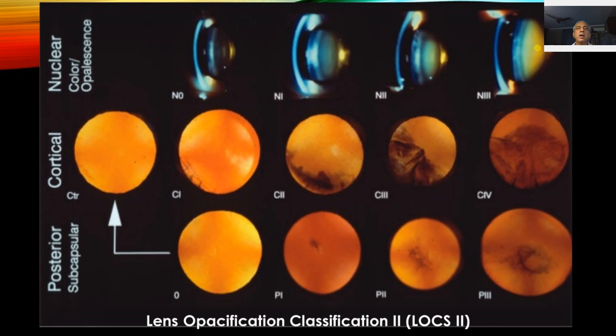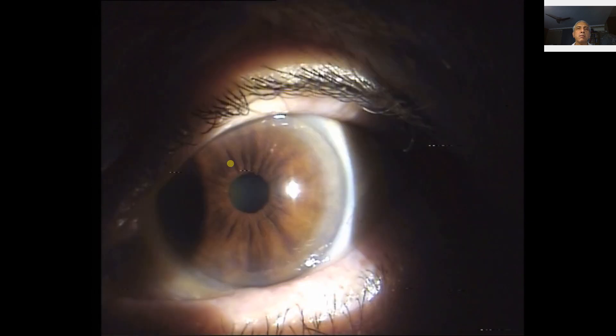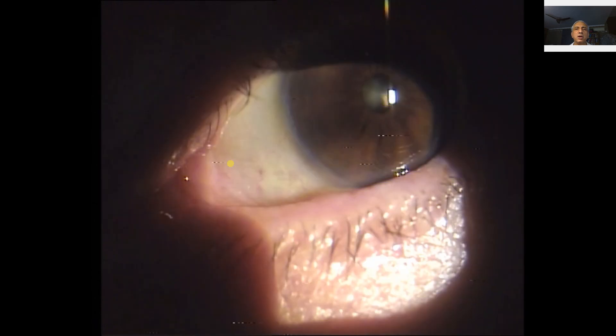When you do diffuse illumination on the other eye of this patient, you can see the anterior chamber is shallow. You can see a slightly greenish reflex. The pupil is constricting. In slit lamp examination, you look at the lids for blepharitis, check the puncta for occlusion, assess the tear lake for epiphora. On higher magnification, there's very little space between the slit on the cornea and the surface of the iris, showing a very shallow anterior chamber. This patient would need gonioscopy, and if the angle is shallow, you would do YAG iridotomy.